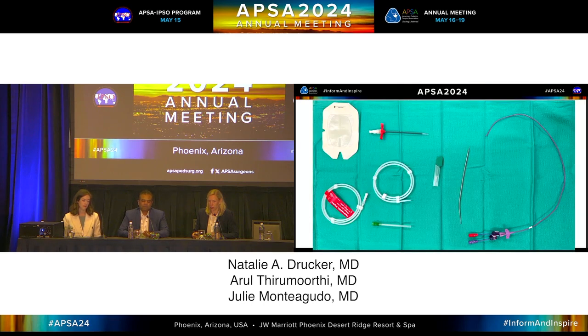So it comes with Seldinger technique with a peel away sheath. You can do it that way. You can do it through a cut down. Any of the access techniques we've described, you can do it.